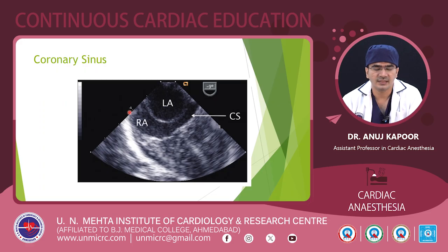Lastly, the coronary sinus. When we are in a mid-esophageal four-chamber view, we slightly insert the probe and go deeper, and we can see the coronary sinus, and whether it is draining into the RA. If it is an unroofed coronary sinus draining into the LA, then we will have to ascertain it and inform the surgeon, and thus the defect can be closed.